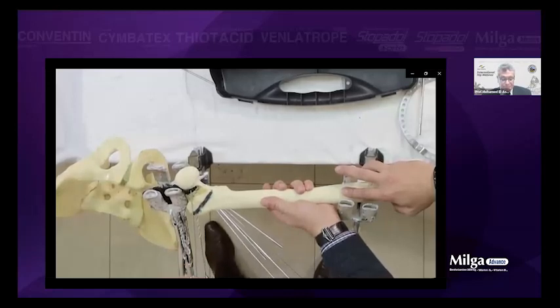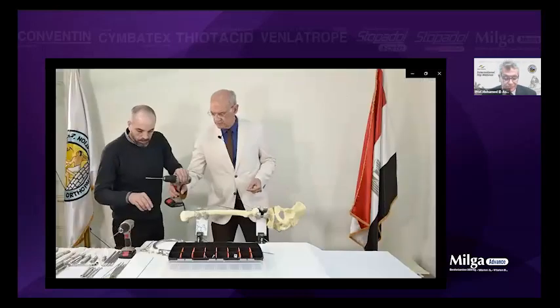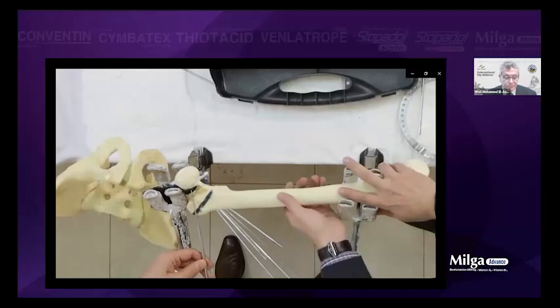And this way, you can change the angle of anteversion. We knew the angle of anteversion from this wire, the superficial wire. So it's about 15 degrees. So you can move it up and down to correct the anteversion. Then you go with the drill bit. You see, you went through the bone. Then we remove it. Then manually you introduce your Schanze screw.